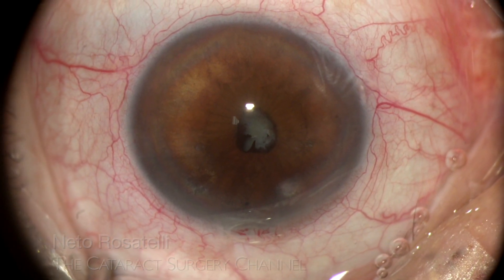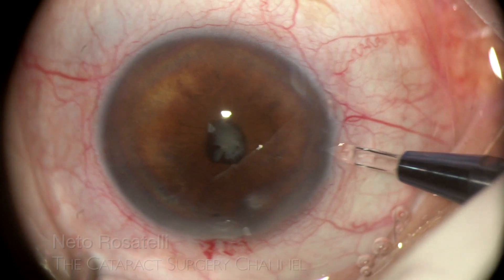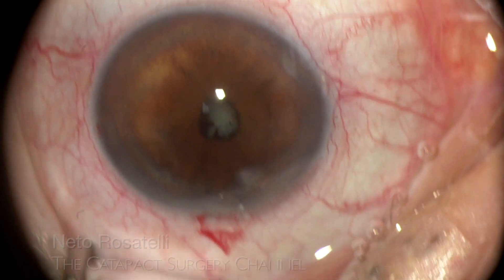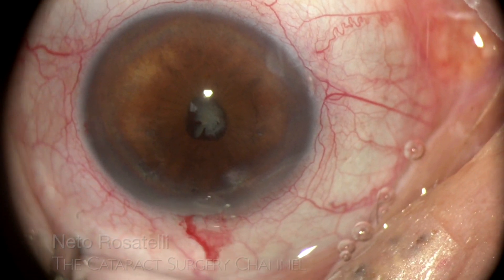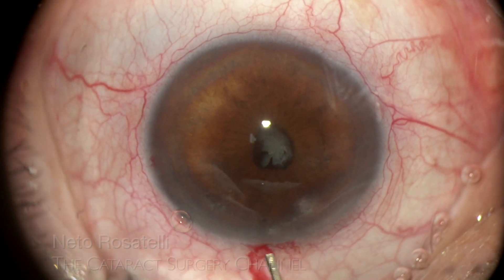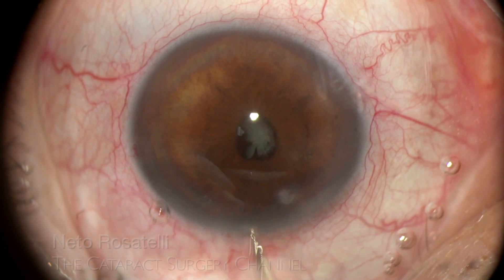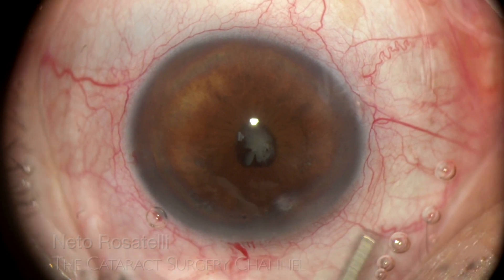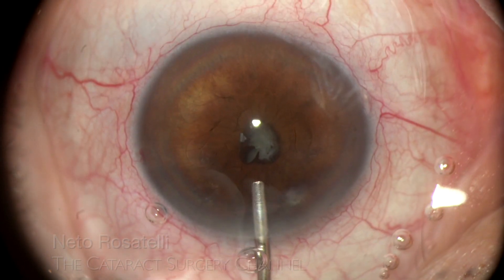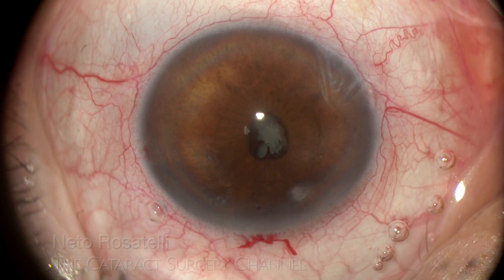The main 2.8 mm incision is done, along with a 1 mm left and also a right side port, to help address the fibrotic pupil and the B-hex placement. The patient is under peribulbar block, but I complement with intracameral 0.5% lidocaine. Dispersive OVD fills the anterior chamber and we are ready to go.